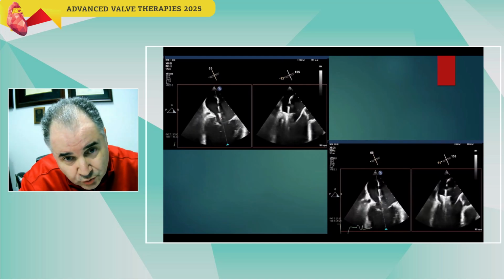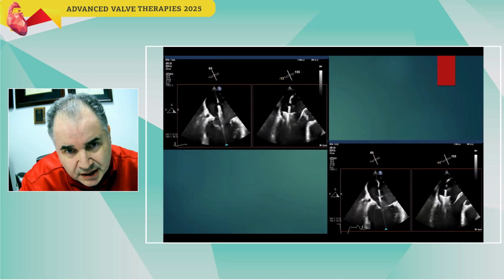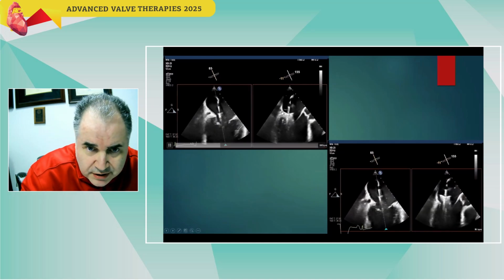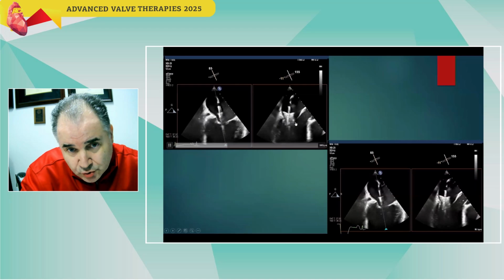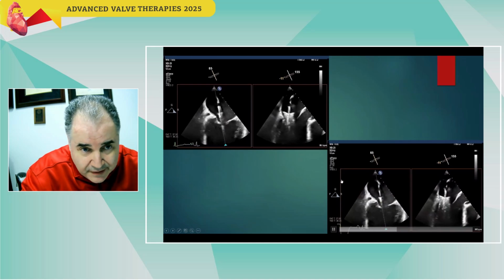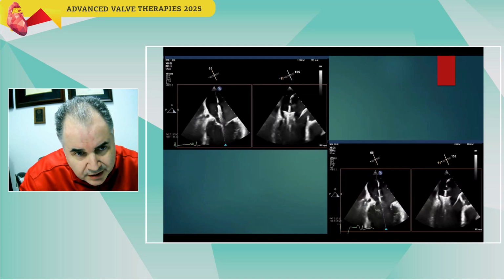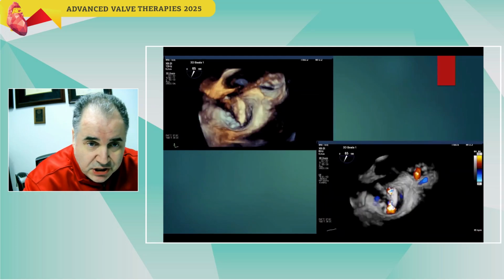we were doing this procedure. Today, the clip has an independent grasping ability, which is very critical, especially for difficult anatomies. As you can see here, you should know which is the anterior and which is the posterior gripper. This is the anterior gripper with the anterior mitral leaflet, and this here in the bottom is the posterior. So you have to know which is what, and having the ability to grasp independently is very, very important and has made this procedure much, much easier.